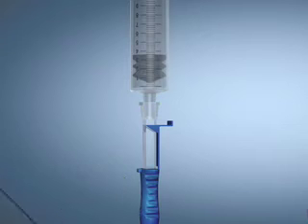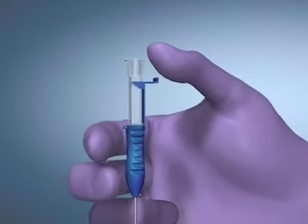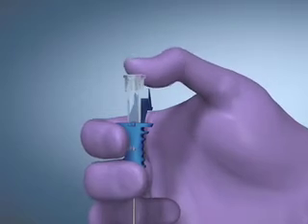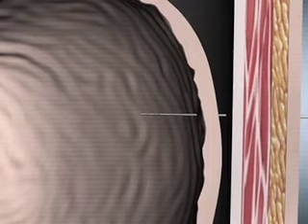After confirmation of correct position, release the suture strand and remove the syringe from the device. Bend the locking tab on the needle hub. Firmly push the inner hub into the outer hub until the locking mechanism clicks into place. This will dislodge the T-bar from the end of the needle and lock the inner stylet into position, blunting the needle.